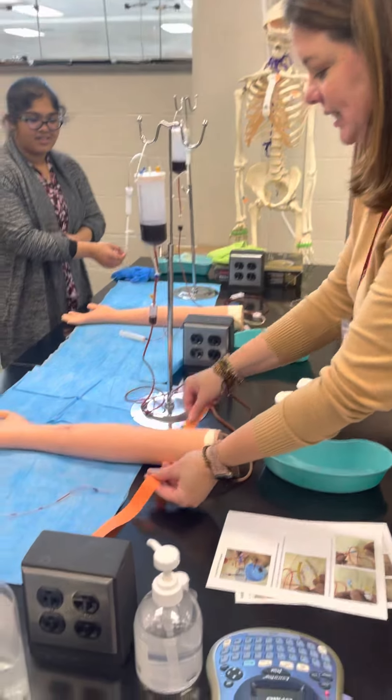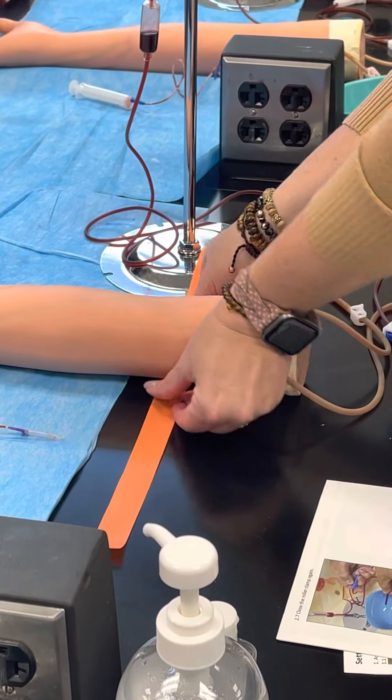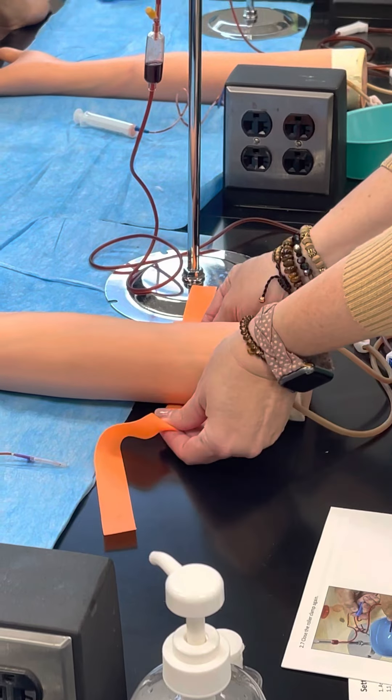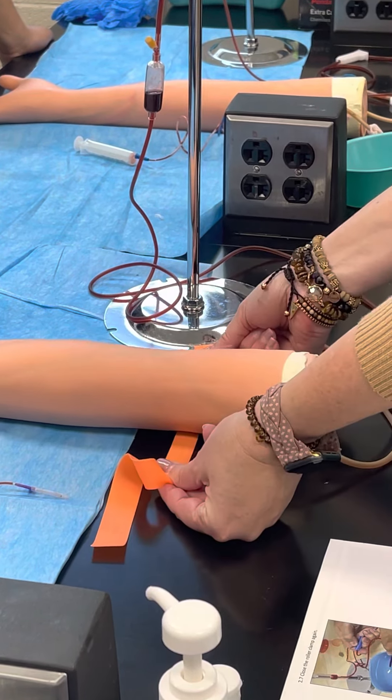Try to get zoomed in on how I do the tying of the tourniquet as well — watch me. Remember, you need to make sure that you are pulling the tourniquet tight before you wrap it so that it doesn't pull on their skin or their hair.